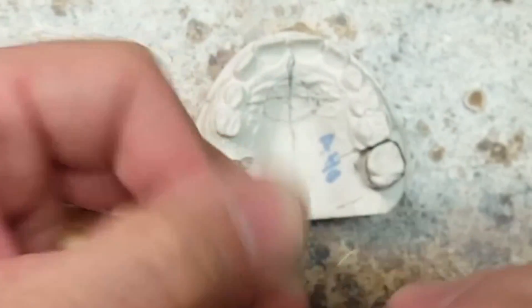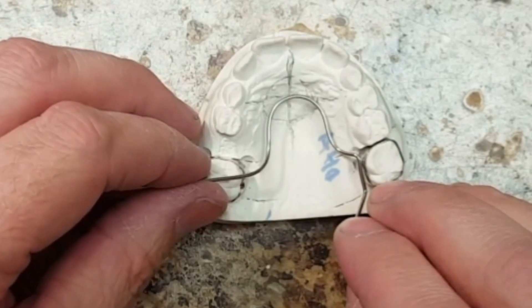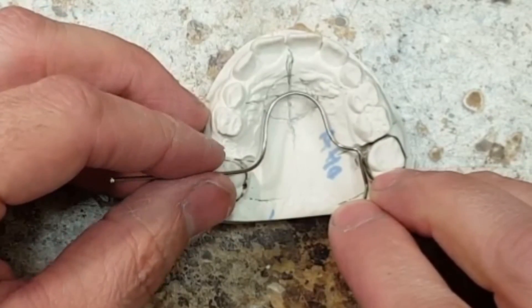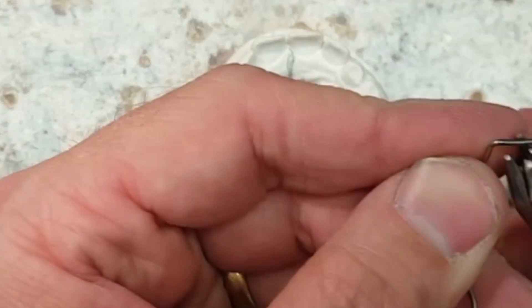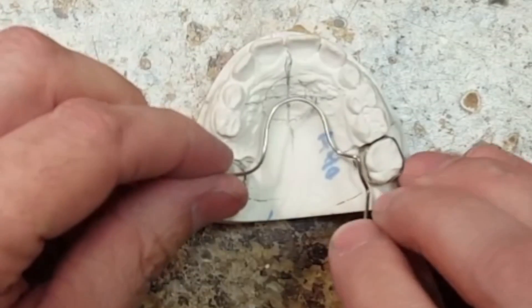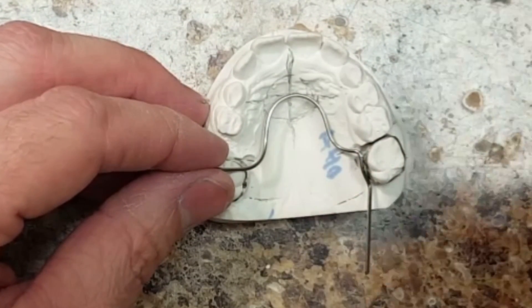This bend that I just put right here is a great little trick — now I have something to hold the wire to make adjustments. If you cut the wire right at the band, you won't have this and it makes it incredibly hard to bend the rest of the appliance. This way I have a firm grip on the wire and I can make all kinds of adjustments by having that extra wire hang out.